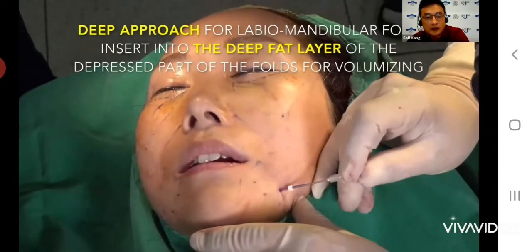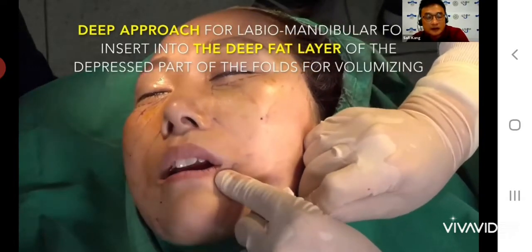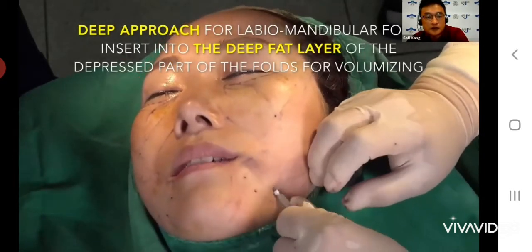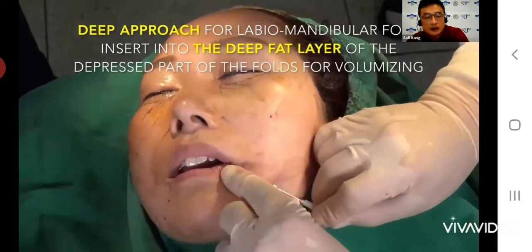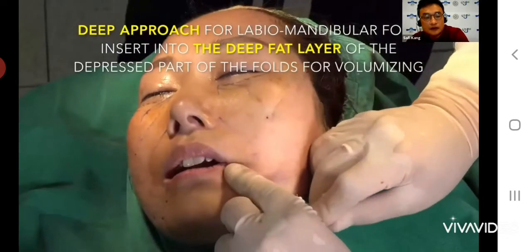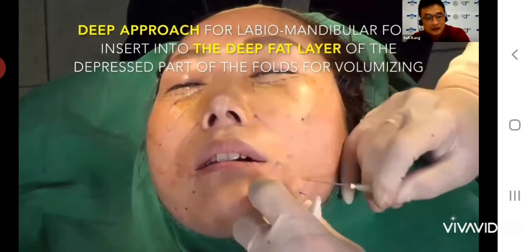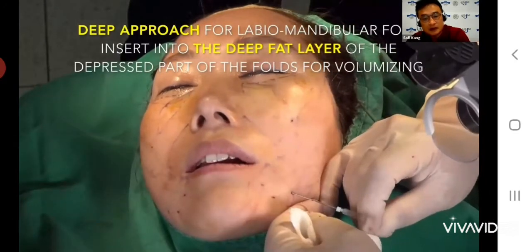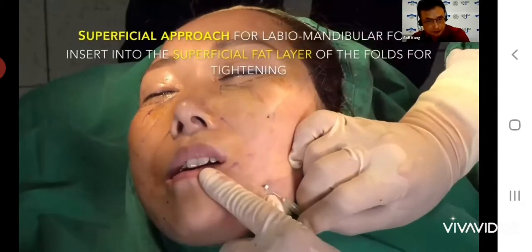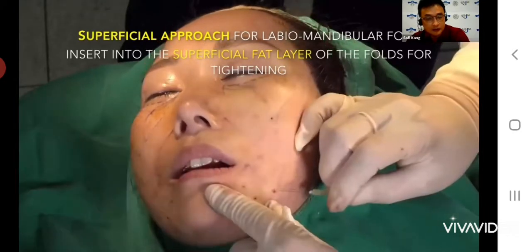When I mark for the planning, I mark the deepest area, and then I put in the thick thread, the mesh-type cylindrical thread. For each size I usually use 3 to 5 threads to cover the dead space. So in this case, I push back again, and then we can put it into the dead space.